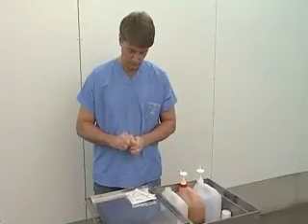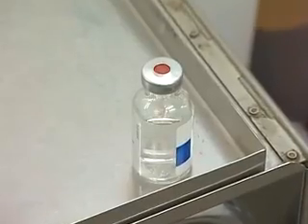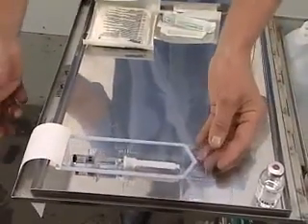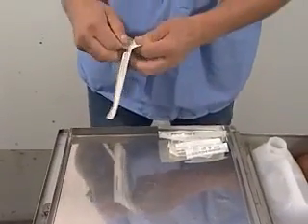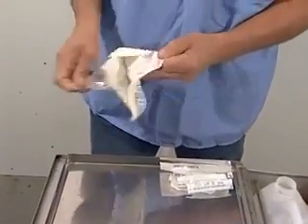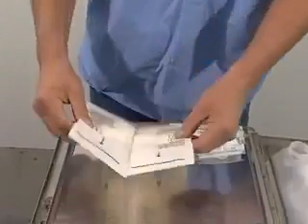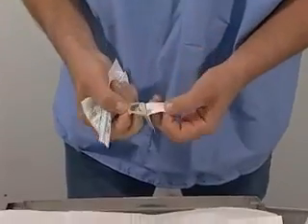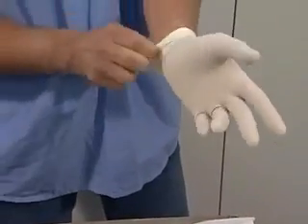The veterinarian positions all non-sterile materials such as bottles of local anesthetics within easy reach. Non-sterile outer packaging is also opened to allow the vet to access the sterile content after putting on sterile gloves. The veterinarian opens the envelope containing sterile gloves and unfolds it, taking care not to touch the inside of the envelope. This area is now sterile and can be used to place all sterile equipment, for example needles and syringes. The vet puts on the sterile gloves.